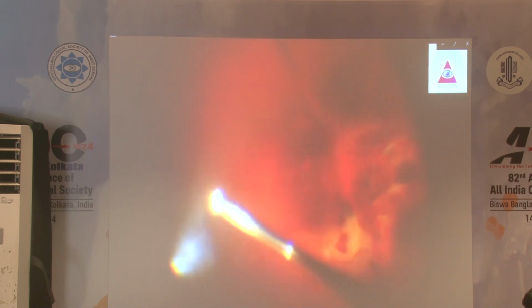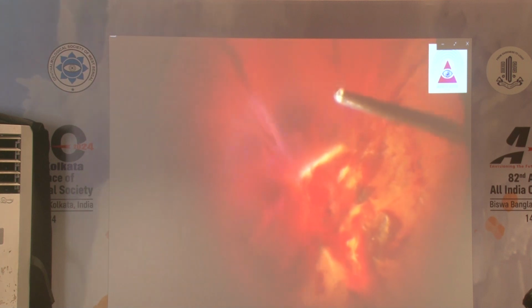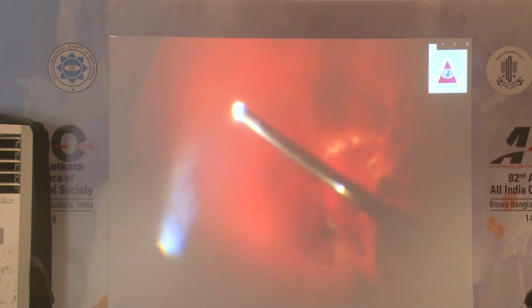Last case is of a vitreous hemorrhage with PVD seen on ultrasound preoperatively but turns out to be a vitreoschisis intraoperatively. In these cases you have to be careful, as they appear deceptive: there is no PVD present, but only vitreoschisis is seen.